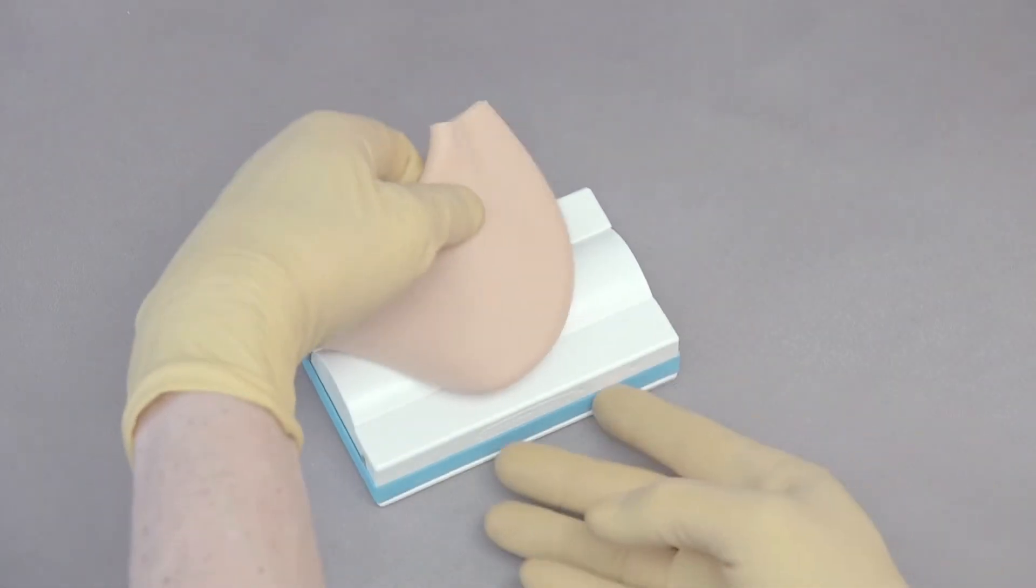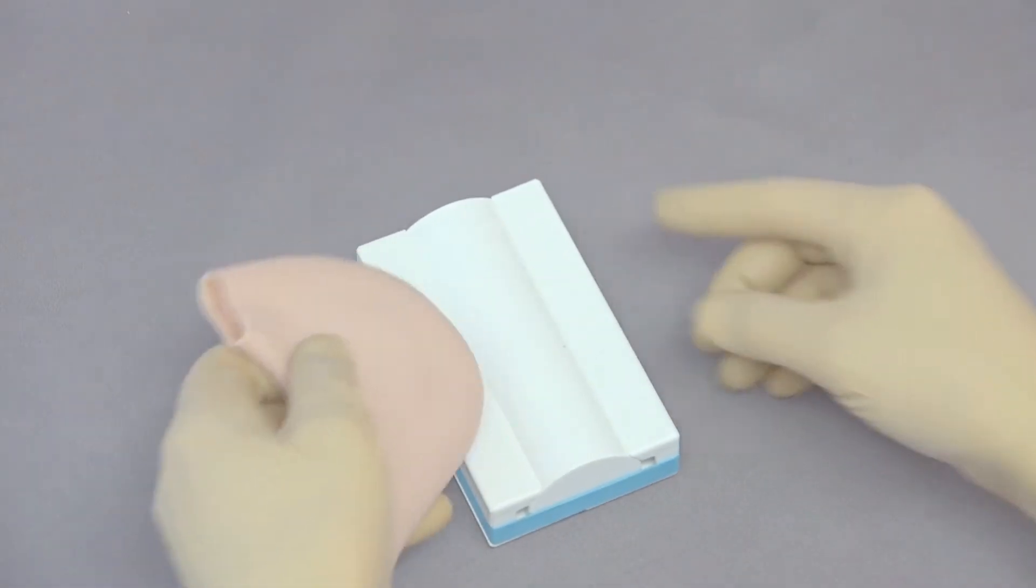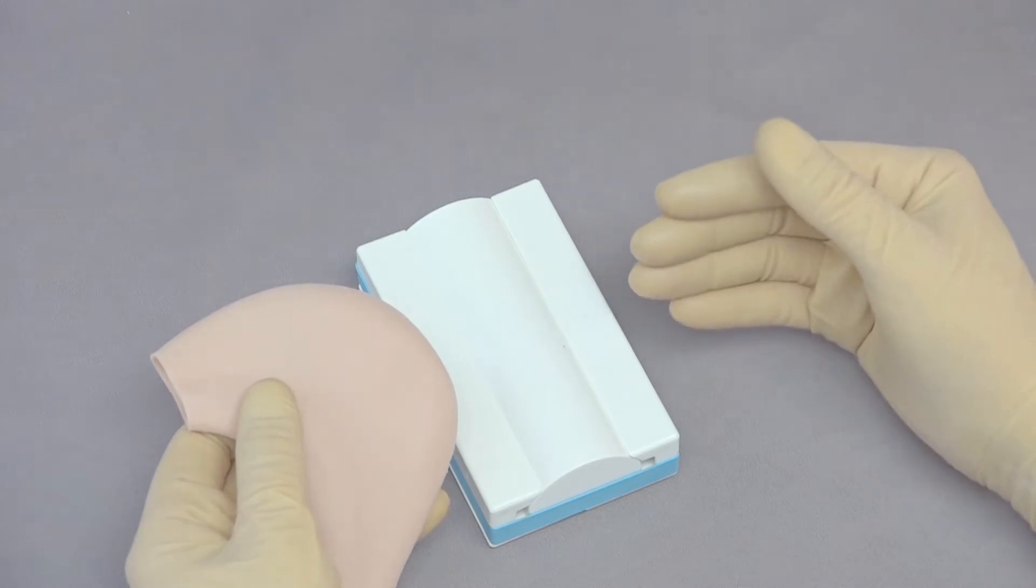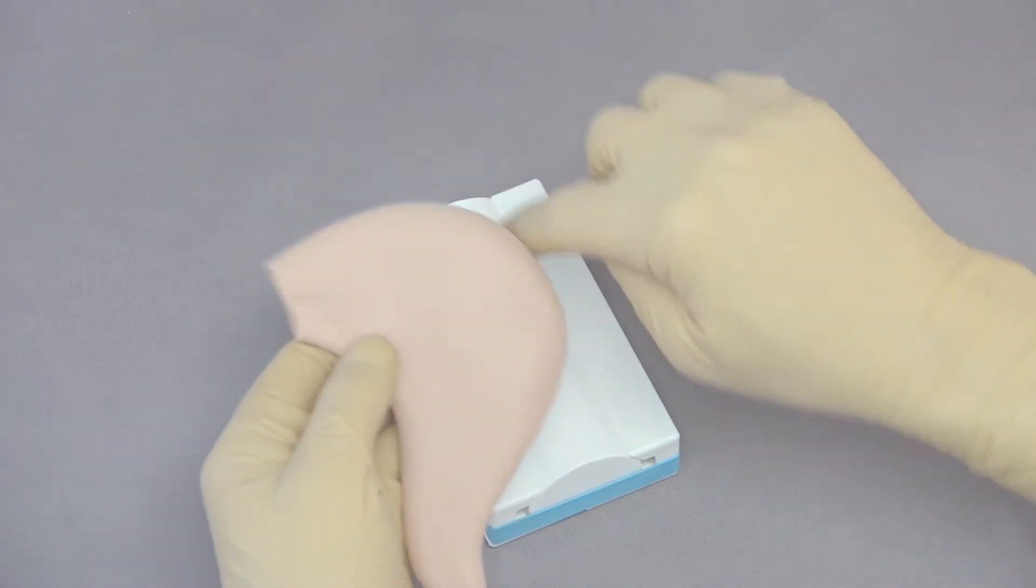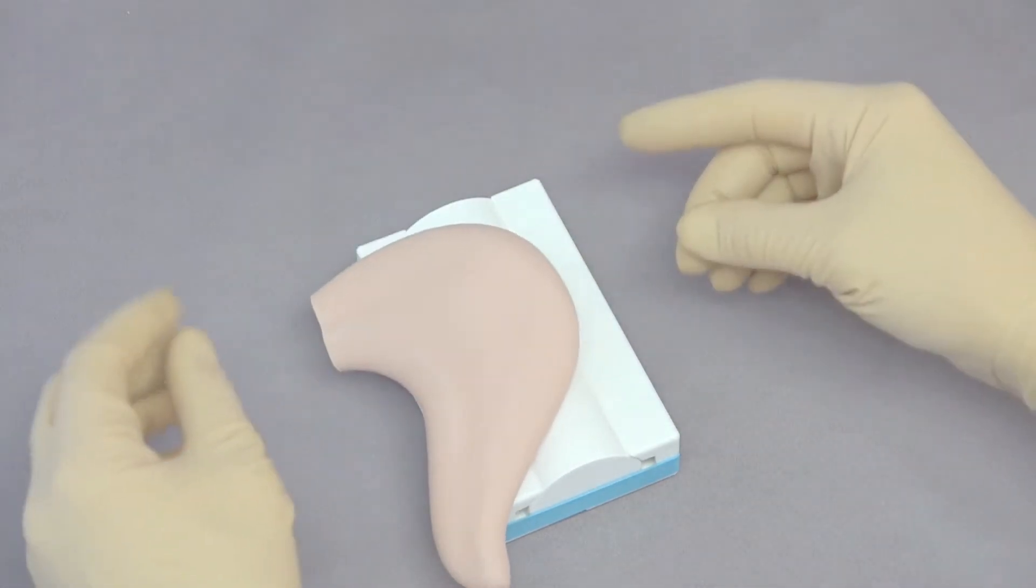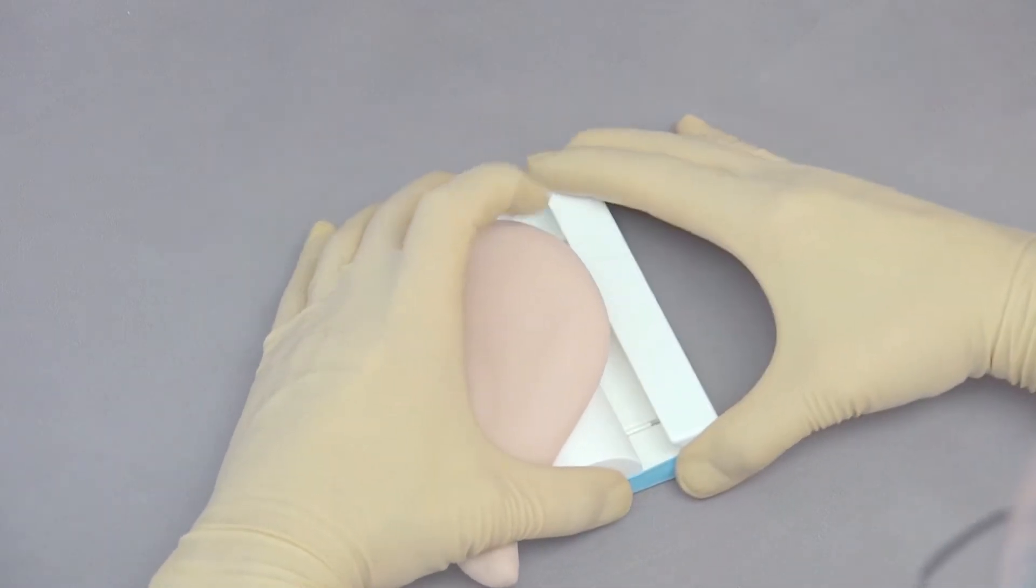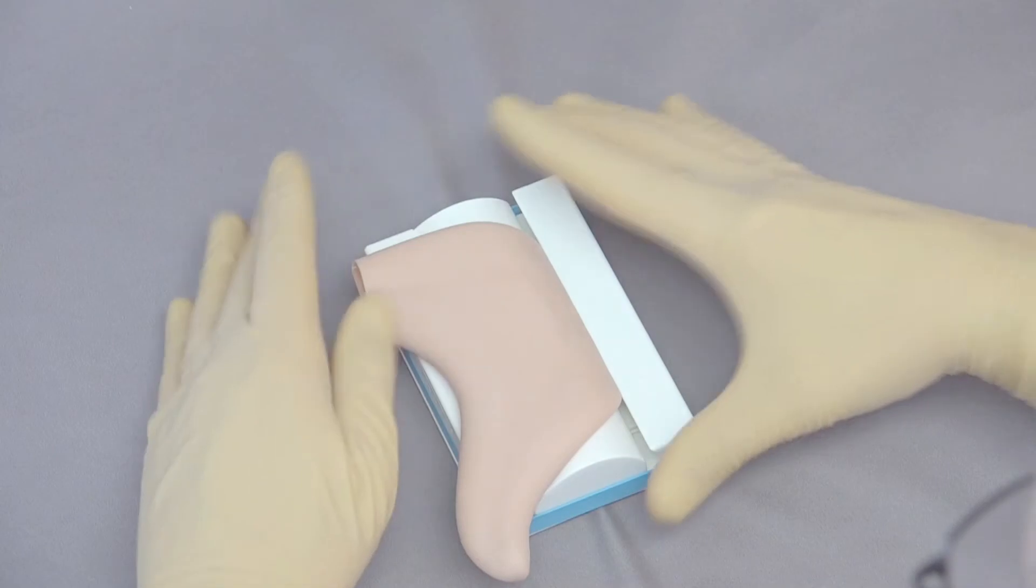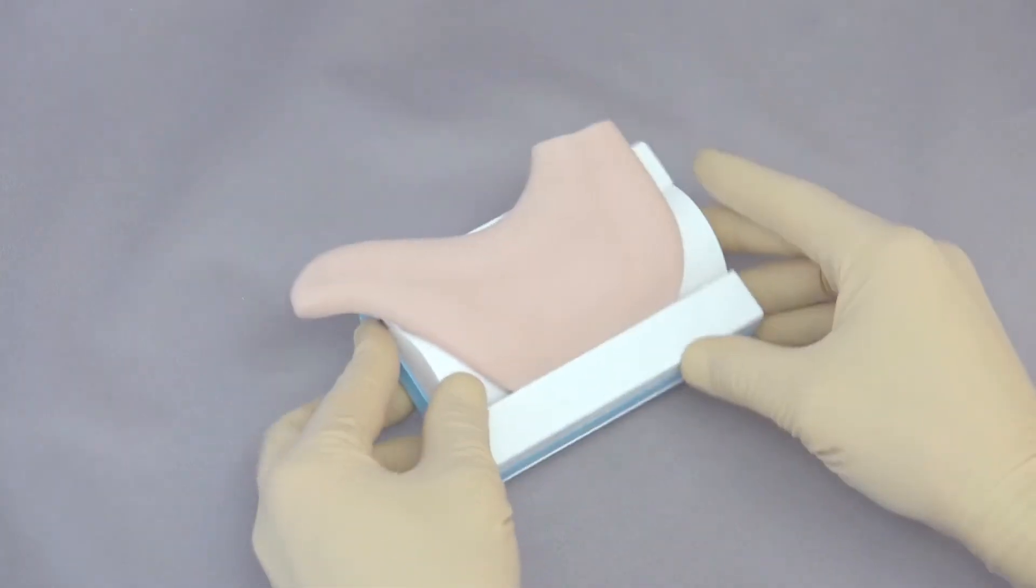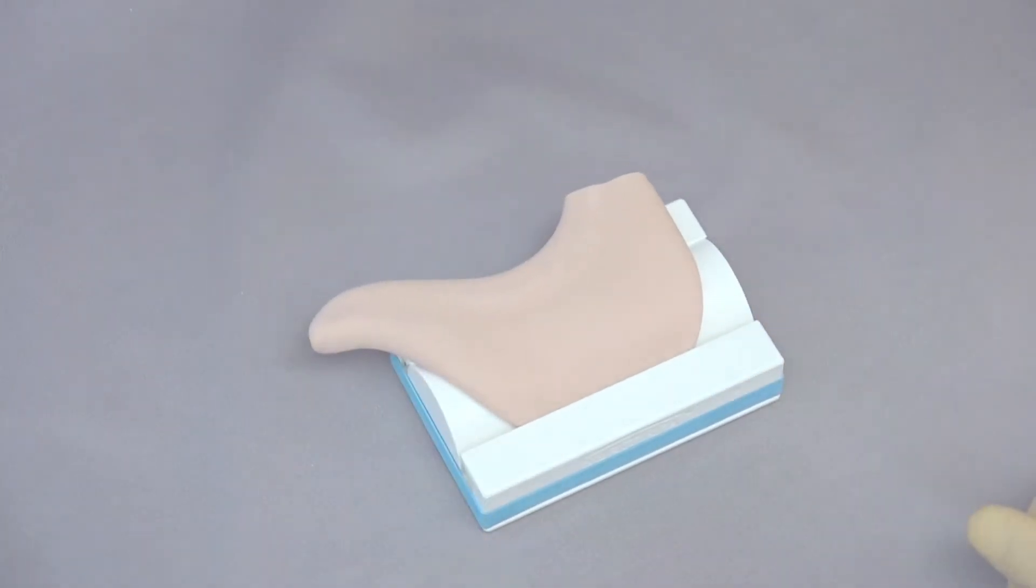The best way to use the tensioning base for the stomach is to turn it to the side so we have the tensioning base perpendicular to our body, have the greater curvature of the stomach facing your right hand, and you can open up the tensioning base and then tighten it down, and that will give you access.